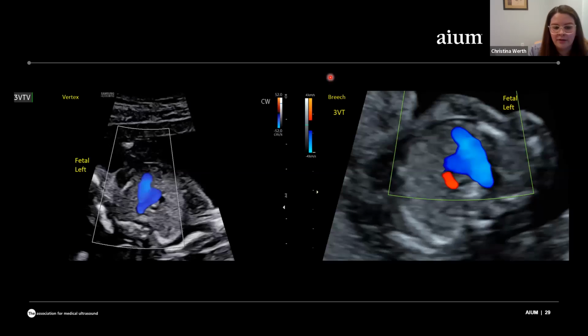And then another thing I like about this view is it's really easy to kind of get an assessment of the hemodynamics of the arches. So it's really telling me not only how many outflow tracts there are, and not only the size, but where is the blood pumping and where is it going? And that can give us a lot of information.